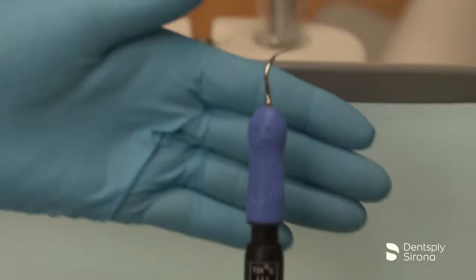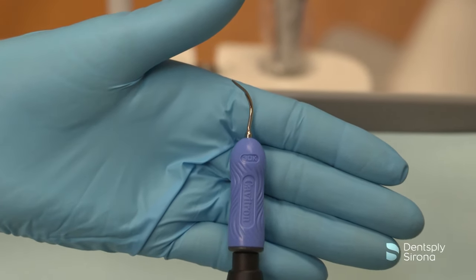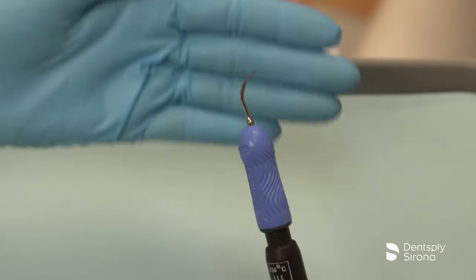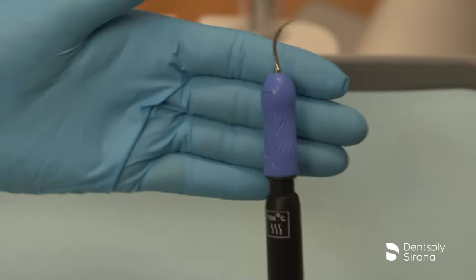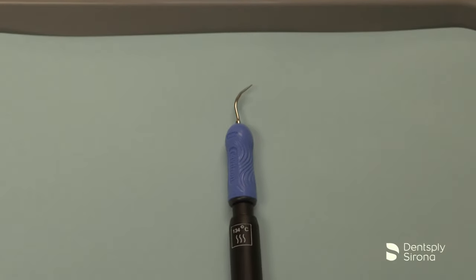This is the Cavitron FSI-100. It is designed for removal of moderate to heavy deposits and can be utilized at all power levels. The Cavitron FSI-100 has two bends to the shank, facilitating access to posterior teeth and aiding in adaptation.